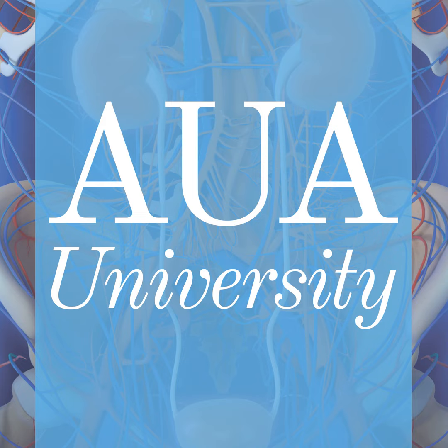So for localized prostate cancer, clinicians should not routinely use CT or bone scan in asymptomatic patients with low or intermediate risk prostate cancer. They should obtain a bone scan and either pelvic MRI or CT scan for patients with high risk prostate cancer. And in patients with prostate cancer at high risk for metastatic disease with negative conventional imaging, clinicians may obtain molecular imaging to evaluate for metastases.